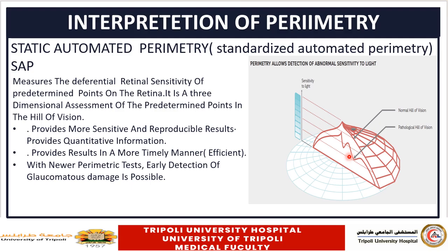screening tests. In the screening tests, we don't give quantifying numbers or any numbers.